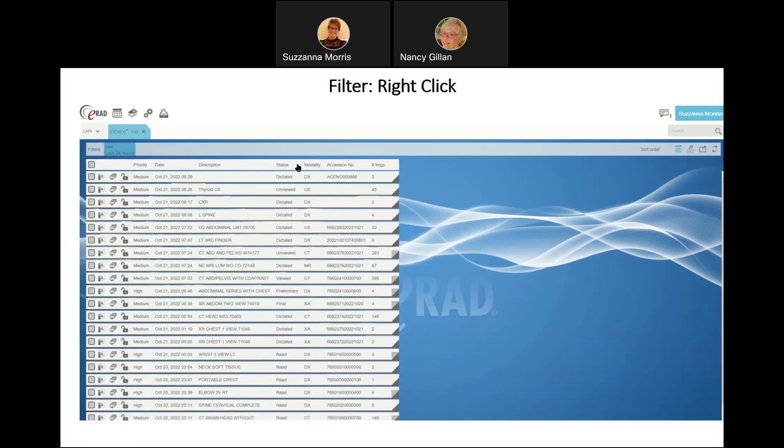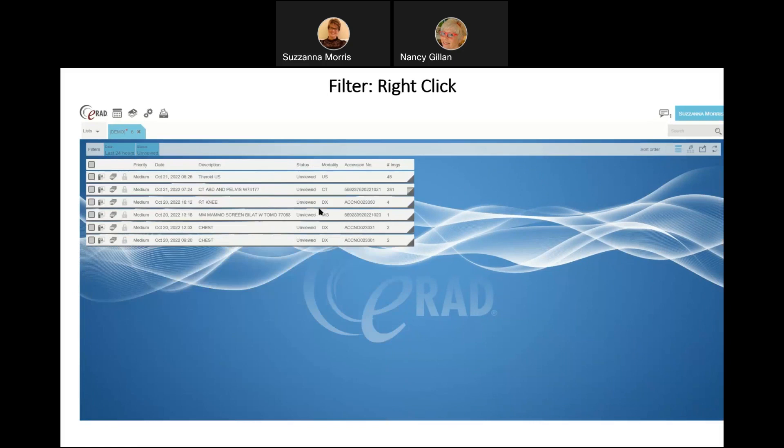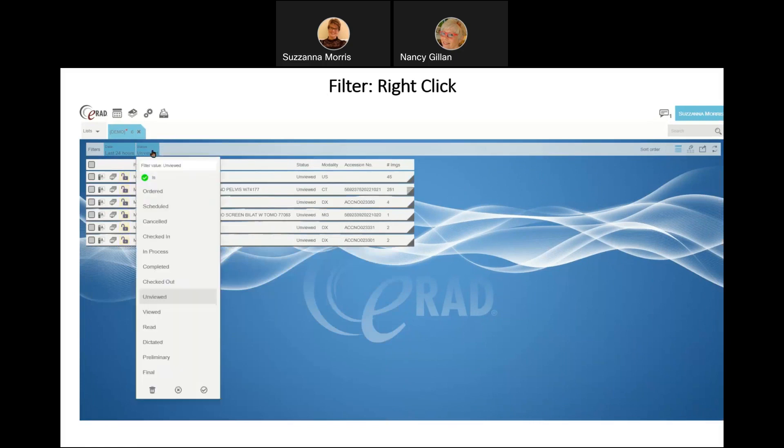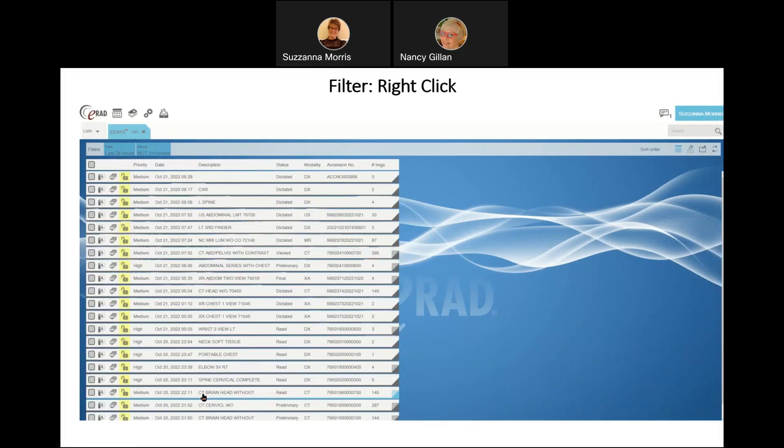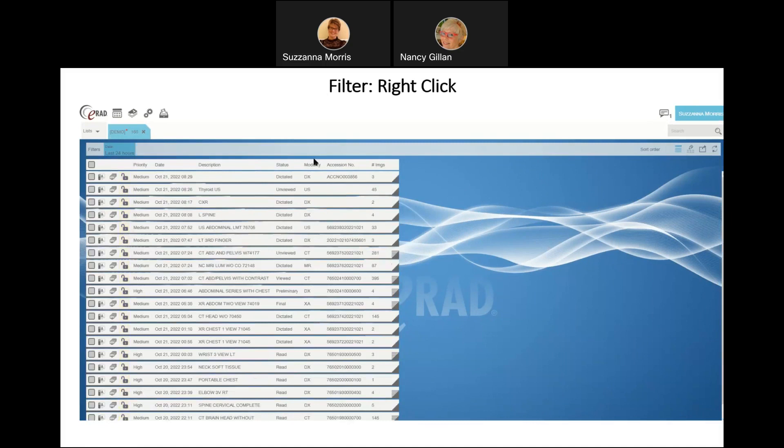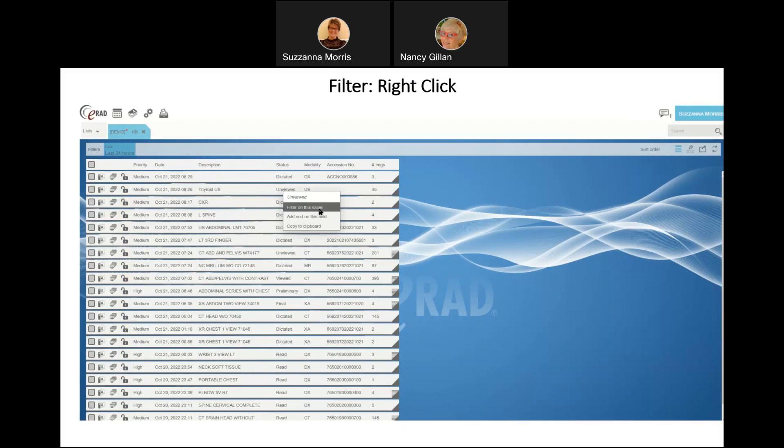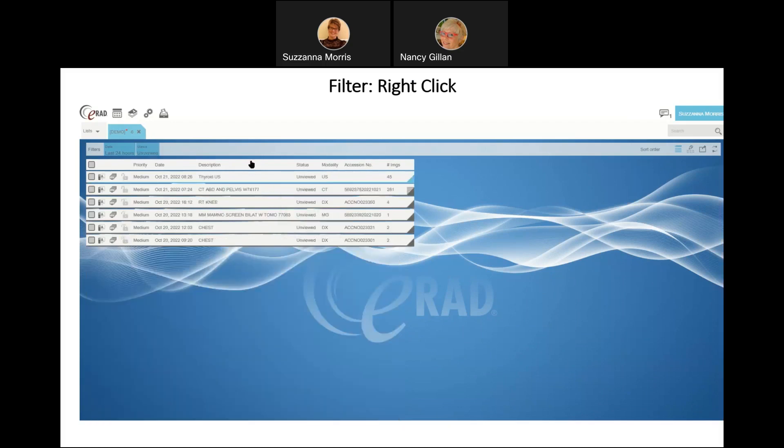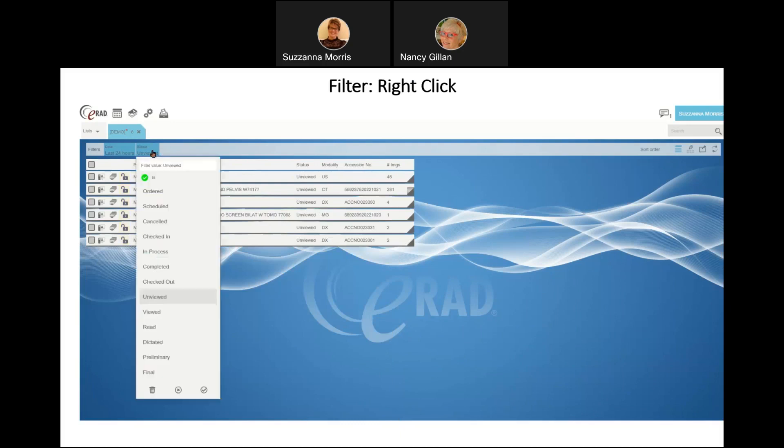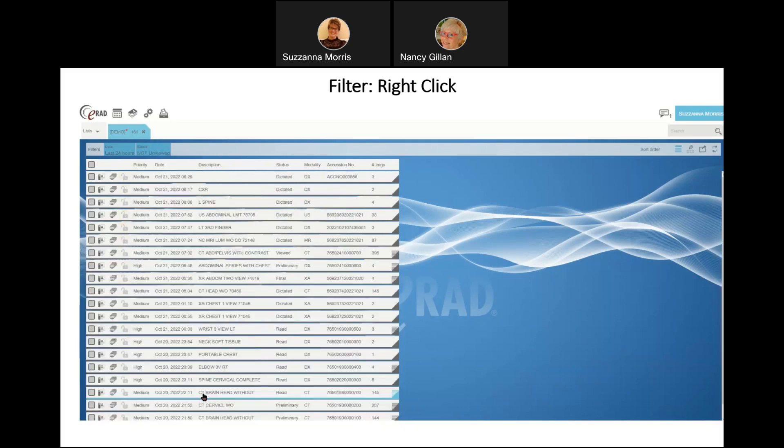The next way that you can filter is by right-clicking. I can right-click on a value. In this example, I'm right-clicking on unviewed and selecting filter on this value. It puts my unviewed filter up at the top, and if I wanted to see everything that was other than unviewed, I would simply select the checkmark beside it and change it to an X. We're going to right-click on the status we'd like to filter by, filter on this value, pops it right up top. Right now we're only filtering on unviewed. If I select the checkmark and change it to an X, it changes our filter value to not unviewed, and it returns everything else in any other status.